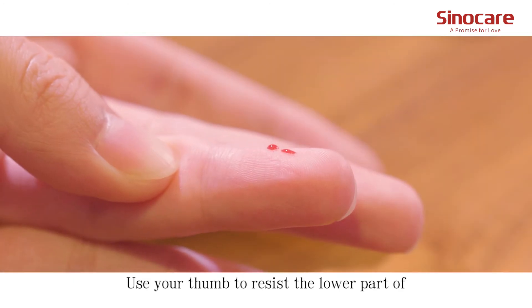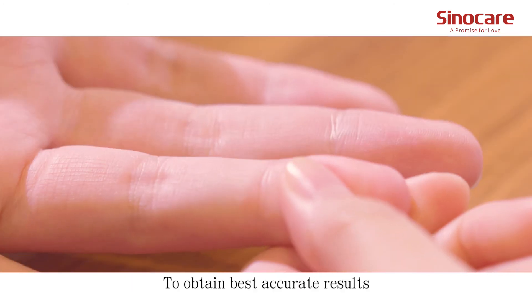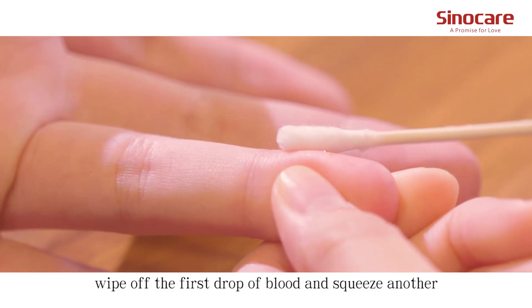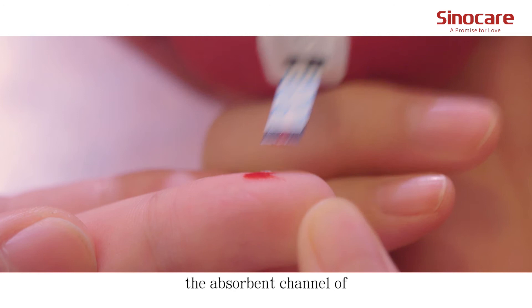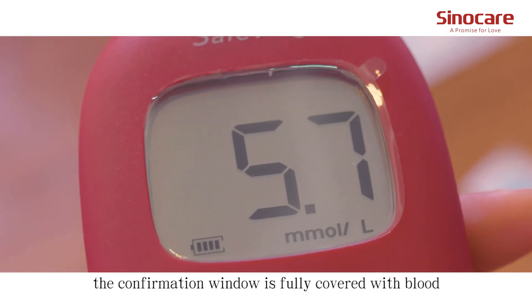Use your thumb to press against the lower part of the puncture site to help the blood draw. To obtain the best accurate results, wipe off the first drop of blood and squeeze another. Apply the blood sample to the opening of the absorption channel of the test strip until the confirmation window is fully covered with blood.